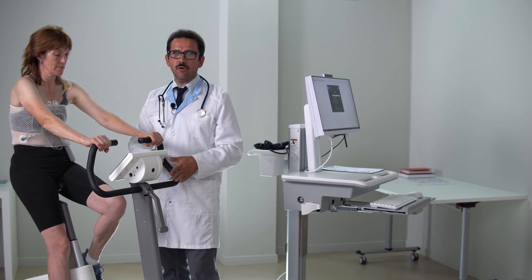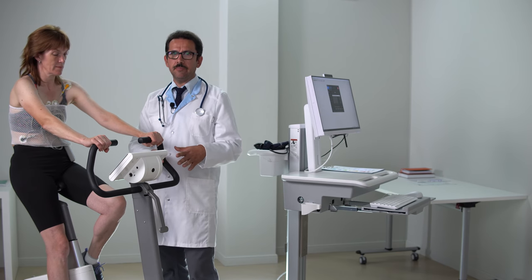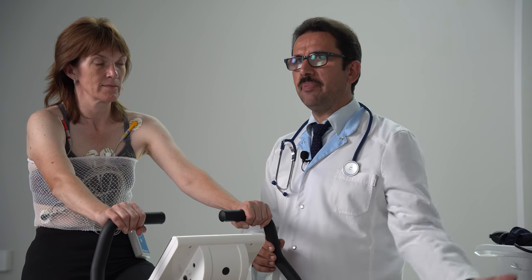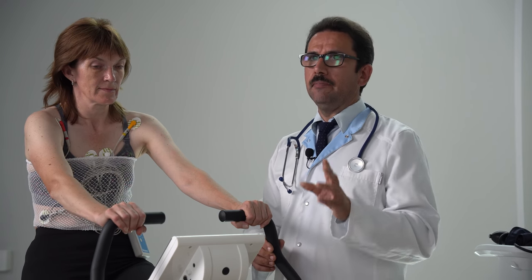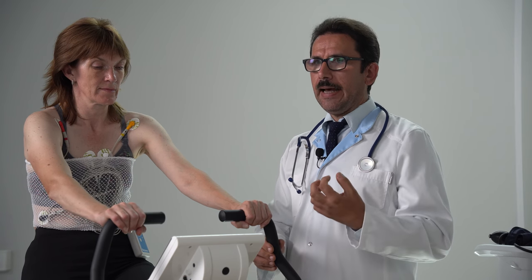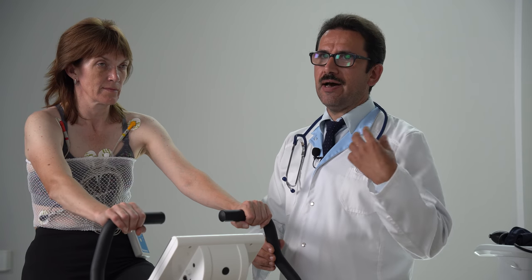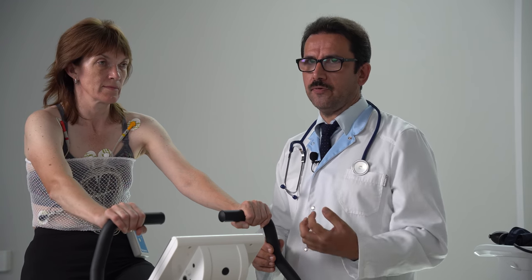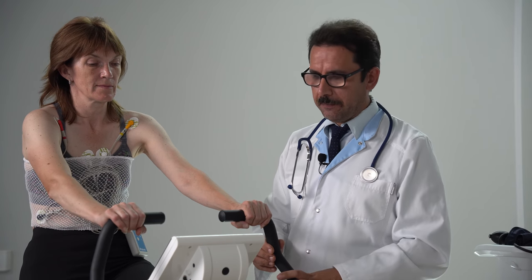This is in contrast to the mechanically braked system, where increasing the pedaling rate increases the load and decreasing the pedaling rate decreases the load. Here, the load is constant, independent of the pedaling rate. But by convention from the past, we have 60 per minute, and that's okay. But when the load goes higher, the patient may feel that the power he must put on the pedal is too big for him. It is too hard for him to push the pedal. And that's why we can ask to pedal at a higher speed, 70, even 75. And it will provide the feeling of easier work for the patient. But the actual work will be the same.